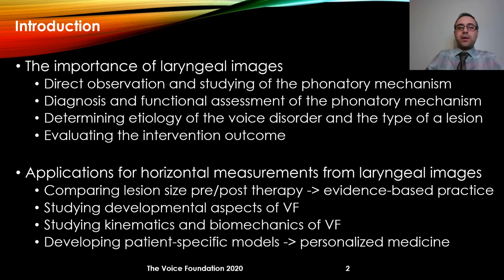At the same time, if we are able to make measurements from the images, we can, for example, compare the size of a lesion pre and post therapy. So that could advance evidence-based practice in the field. Also, we can use measurement for studying developmental aspects of the vocal fold and also kinematic and biomechanics of the vocal fold. Additionally, if we are able to make measurements from vocal folds, we can create computational models that could help us to advance personalized medicine in the field.